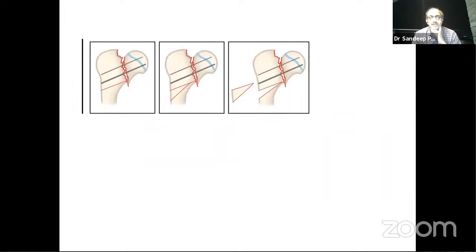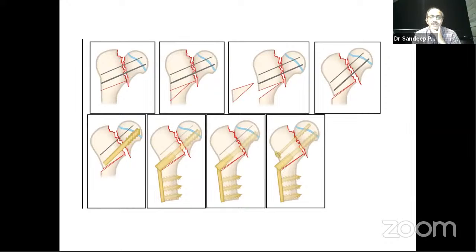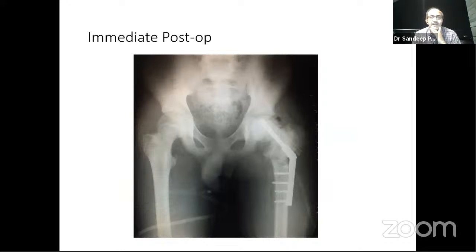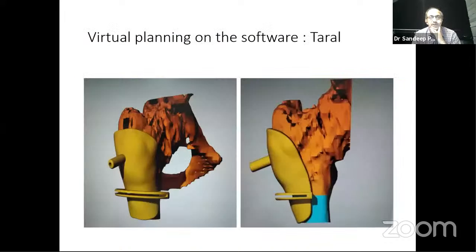So a subtrochanteric, intertrochanteric valgus osteotomy, oblique kind of an osteotomy, we prefer to use a DHS so that we can lateralize the shaft, as well as you can replace the upper screw with a fibula if you want to augment the bone stock there. So this is what is preferred. These are the intra-op images, and that is how it went on to healing, a single fibula superiorly and a DHS. That's his 2-year post-op follow-up, no AVN, and very good range of movement, functionally normal.